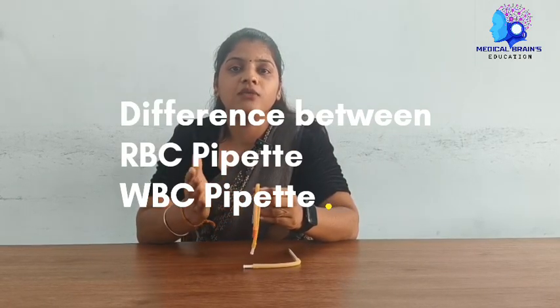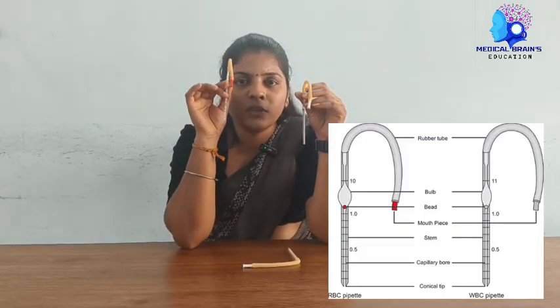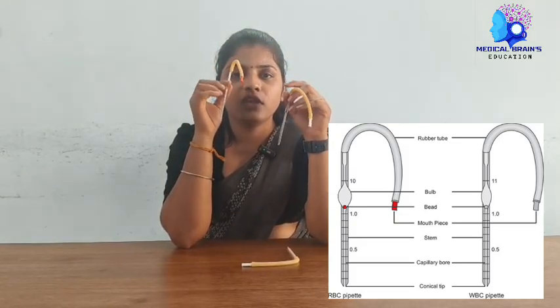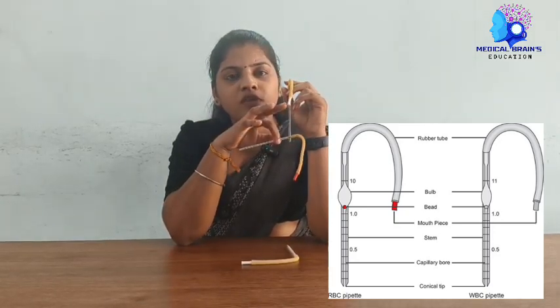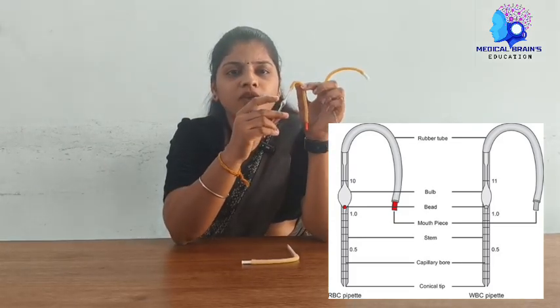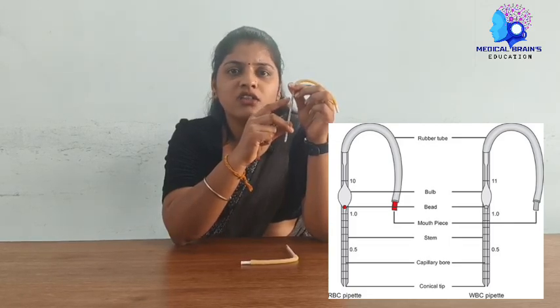Come, let's see what the differences between the RBC pipette and the WBC pipette are. This pipette we will call the RBC pipette and this one is the WBC pipette. The first difference: in the RBC pipette the mouthpiece is red in color. In the WBC pipette, the mouthpiece is white in color. In RBC, the bulb is larger in size. In the WBC pipette, the bulb is smaller in size.